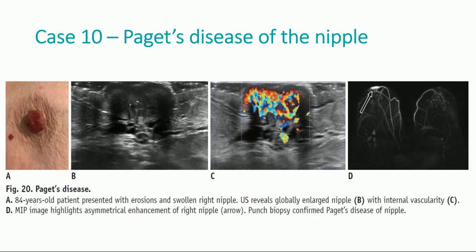Paget's disease in a patient that presented with erosions and swollen right nipple. Ultrasound reveals a globally enlarged nipple with internal vascularity and the typical asymmetrical enhancement on MRI. The punch biopsy confirmed Paget's disease of the nipple.